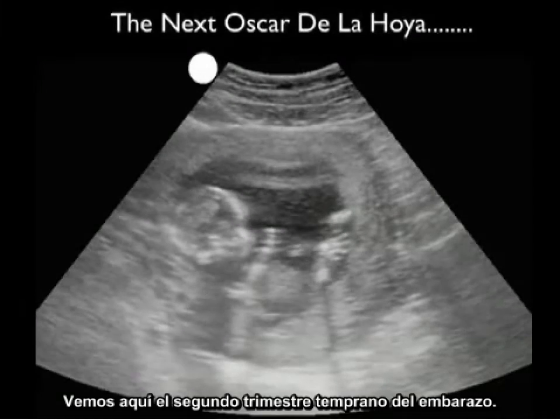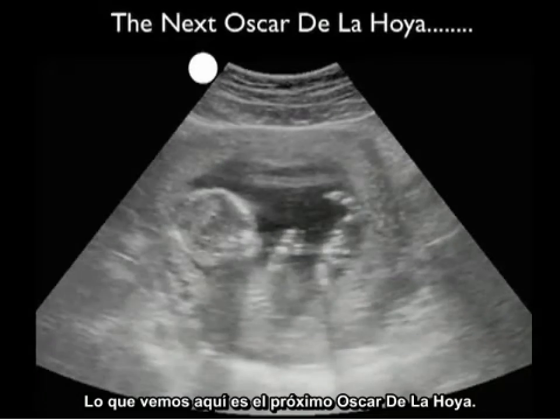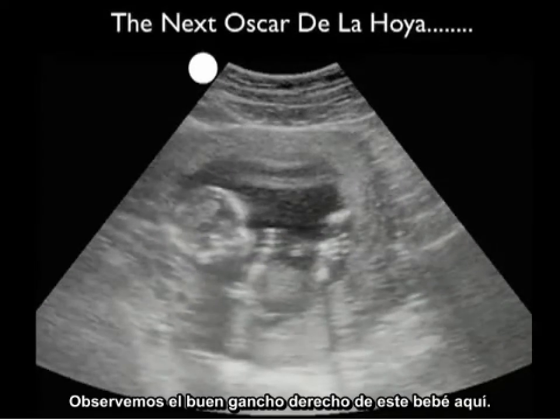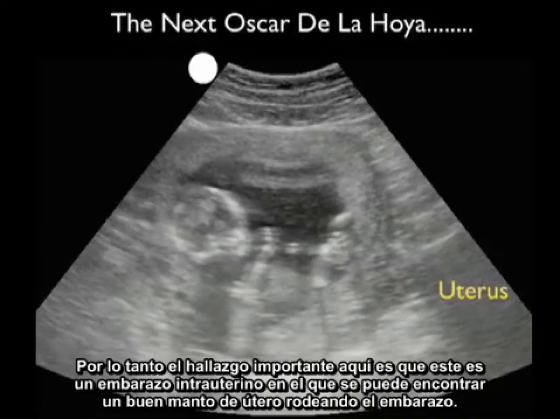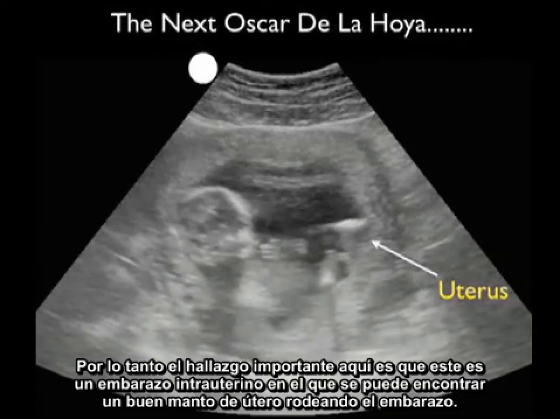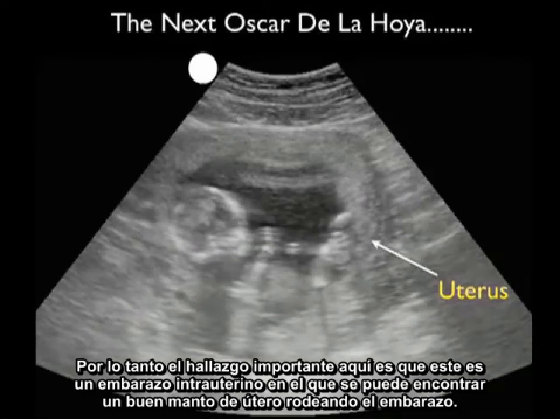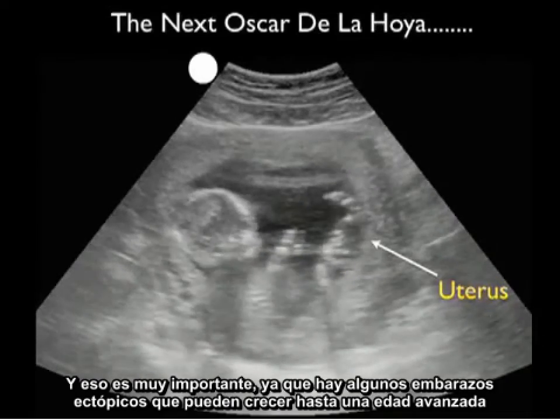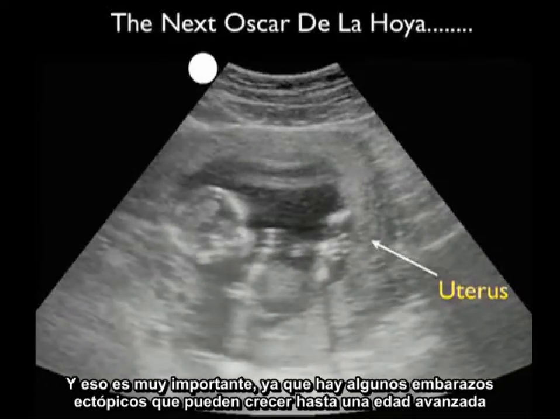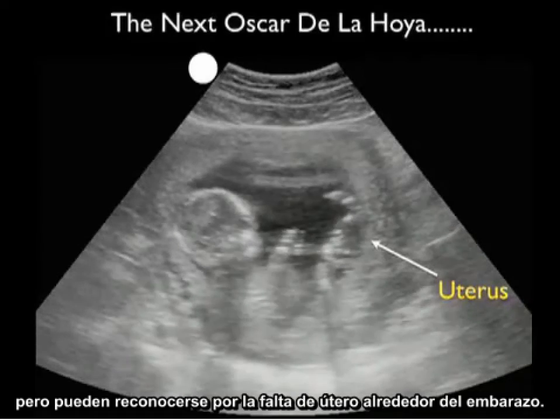Here's an early second trimester pregnancy. The important finding here is that this is confirmed as an intrauterine pregnancy, as we can define a good mantle of uterus surrounding the pregnancy. This is critical, as some ectopics can grow to an advanced age but are distinguished by a lack of uterus around the pregnancy.